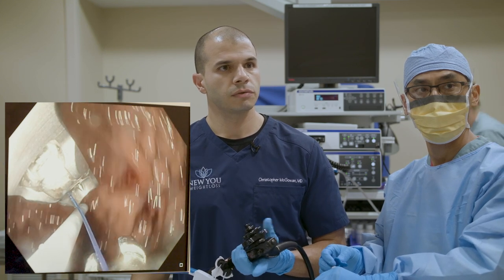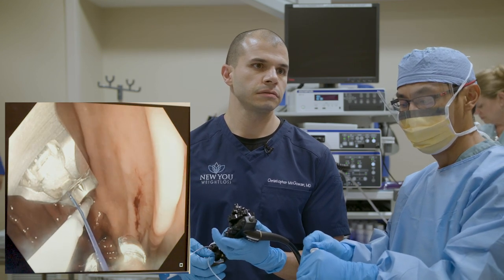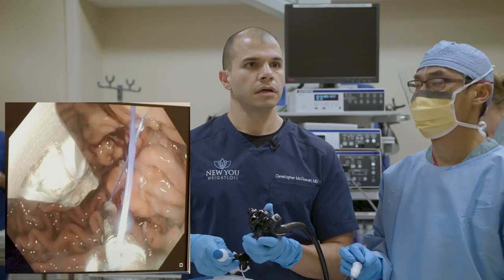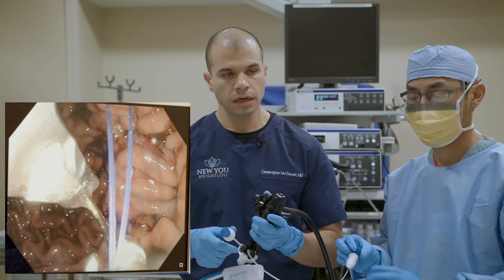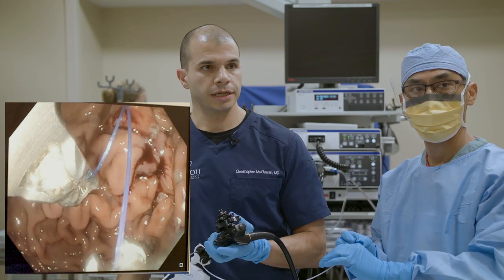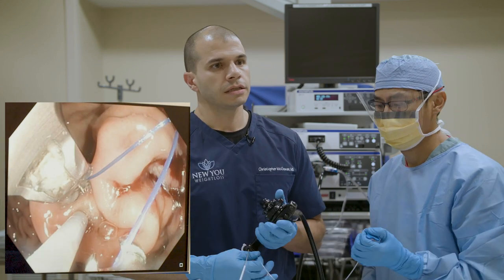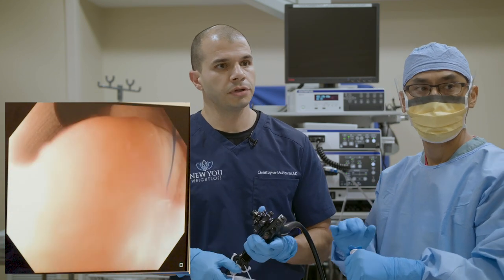We're going right back to where we finished, hugging that area with the next suture. When we first started doing these procedures about a year and a half ago, it took us about two hours and 45 minutes for the first procedure — probably two plus hours for the first ten or more. Now we're down to about 30 to 40 minutes in general. A big shout-out to Dr. Kambari of Johns Hopkins who was here last May helping us start our program and train our team — we really appreciate their help.